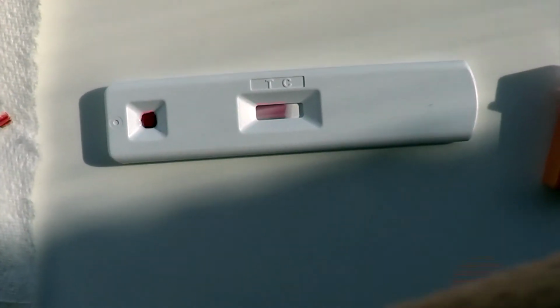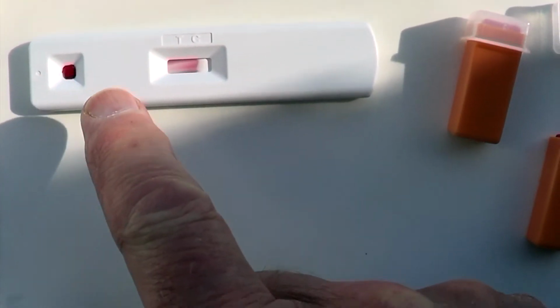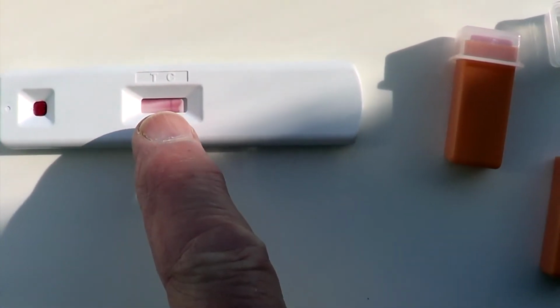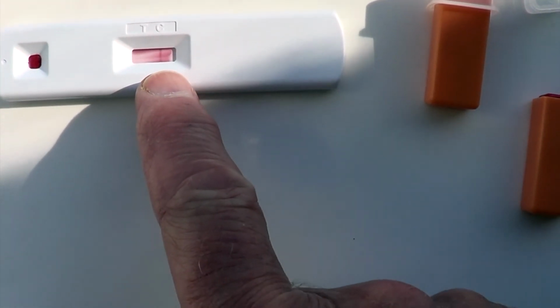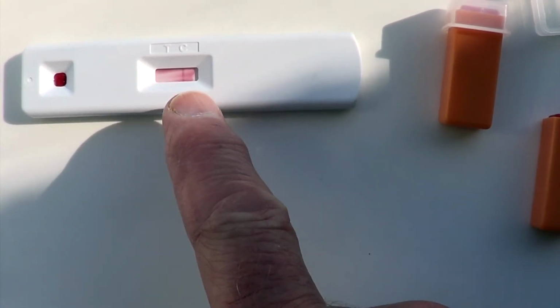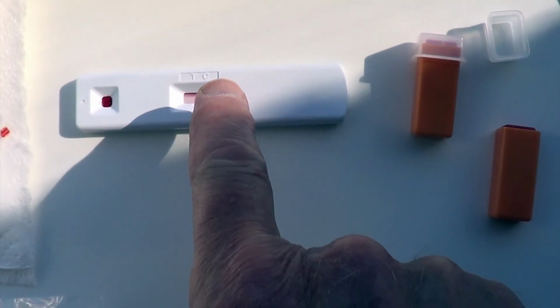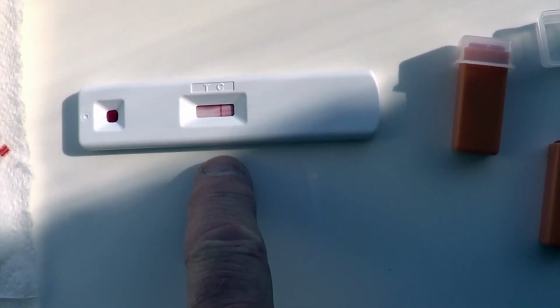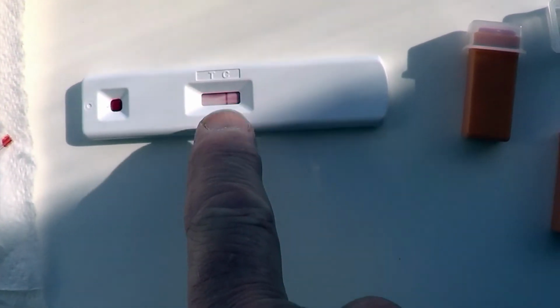What we have is the blood and the liquid added to it, running along underneath here, inside it, all the way along and through this part here. And we should get a double line. We should get a line against the T. Sorry, we should get a double line. We should get a line against the T and another line against the C within 20 minutes. The C one, I believe, is a control one, which shows that the test, I think, has been done correctly. And then the T is the actual test.